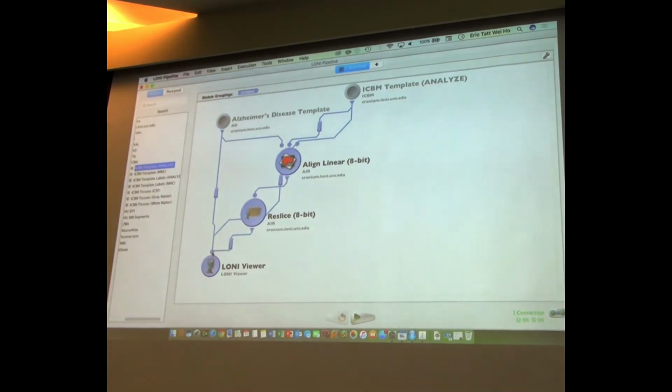So is that right, what I'm doing here? I'm basically writing a script graphically. A very, very simple script: two volumes, align them. Spatial normalization. So now it seems to be working okay.